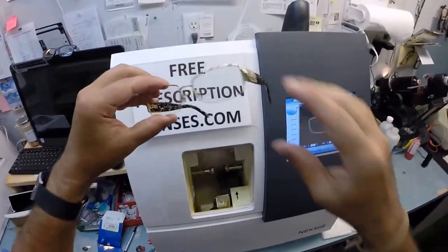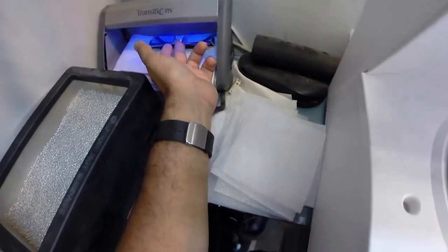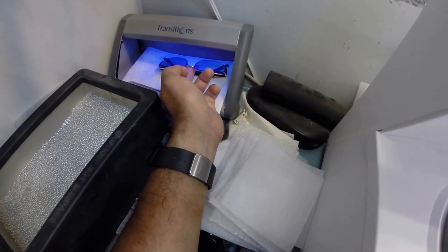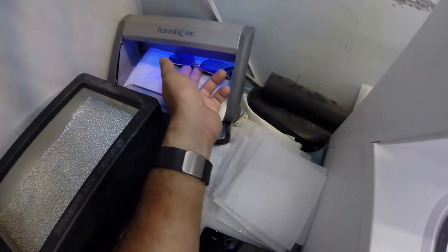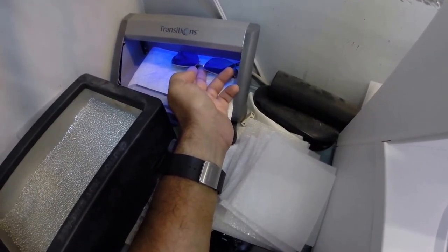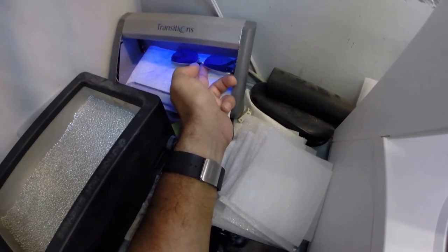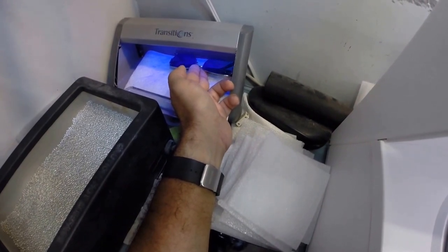When I say wobble, I'm part of that 80%. When I press down on mine, they wobble on the counter, but they sit level on me. And for those of you keeping score at home, I am wearing the Versace 3199 in color 5118, which is the dark blue with the Havana. Havana is just a fancy word for saying tortoise. But let me put mine back on so I can see what I'm doing, yo. Put my Versaces on so I can keep working on your Versaces. Versace, Versace, Versace. So this is what your lenses look like clear. And I'm going to activate them. Expose them to a strong burst of ultraviolet light, my little transitions box here in the corner. As you can see, let me hit the button, it takes about 30 to 45 seconds for your lenses to darken, about 45 seconds to a minute for them to return back to light when you come back inside from outside. Now Angel, pay attention, this is important. All transition lenses will darken on day one. Give them two weeks of exposure to the sun and they're going to continue to darken every day for the first two weeks until they get to their final setting. After that, they will work for years with maximum performance.